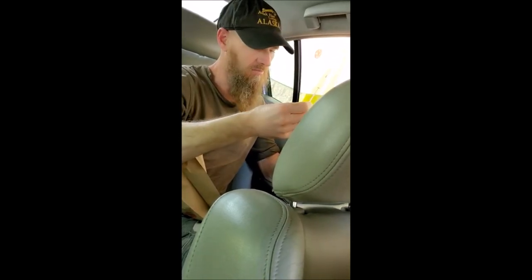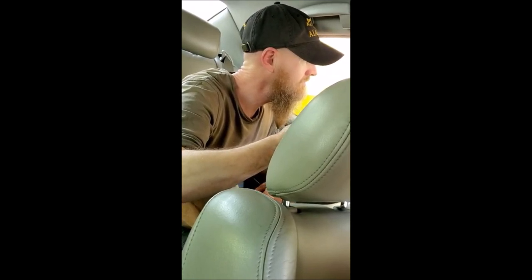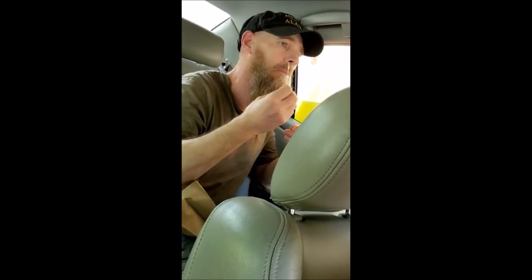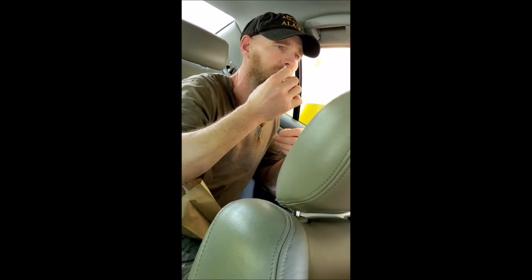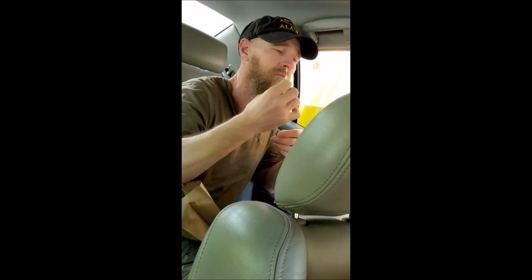Okay, yes, that's how you got to hold it. Now whichever nostril you want, you're going to put it in so it starts to feel uncomfortable, then you're going to be twisting it around. I'll let you know when to start. Yeah, you put it in then you start. Alright, that's good for that side. Now you got to go to the other side because it's the same thing.